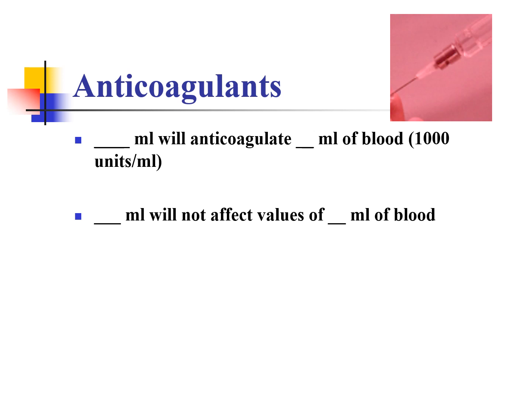Most of the syringes out there are pre-heparinized. You just need to make sure you draw a minimum of, I think, 3 to 5 mLs overall. So you won't have to do this, but if you do have to do this on your own, I would expect these to be on some sort of memory recall document in the near future.